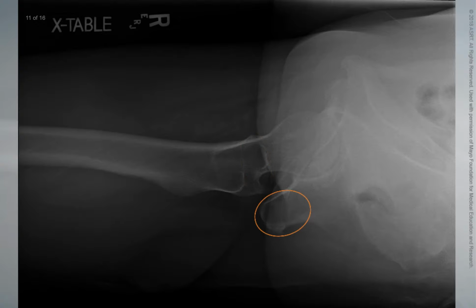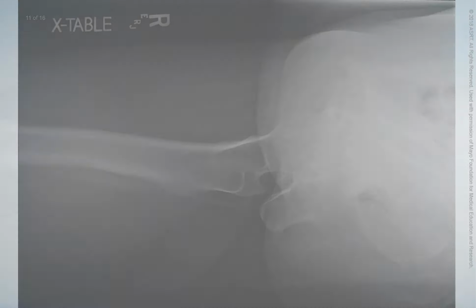The ischial tuberosity is visible below the femoral head and neck, and the soft tissue shadow of the unaffected thigh does not overlap the hip joint or proximal femur. Orthopedic devices, when present, are visible in their entirety, and soft tissue and bony trabecular detail is well visualized. This concludes the clinical refresher for a cross-table lateral hip.